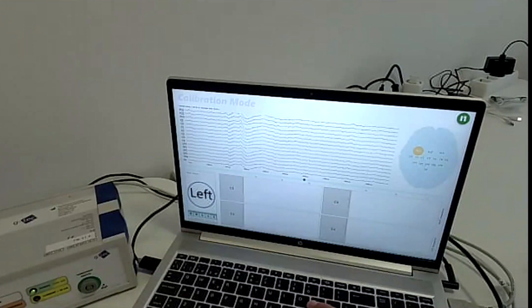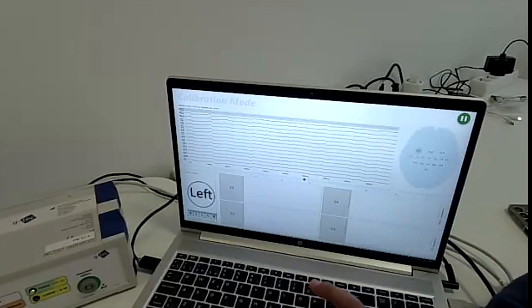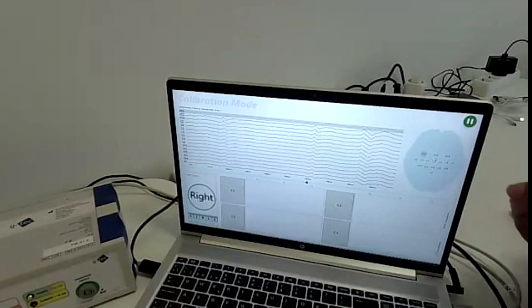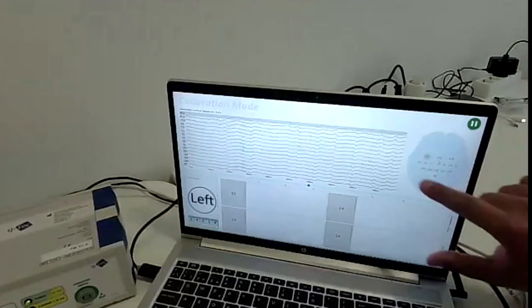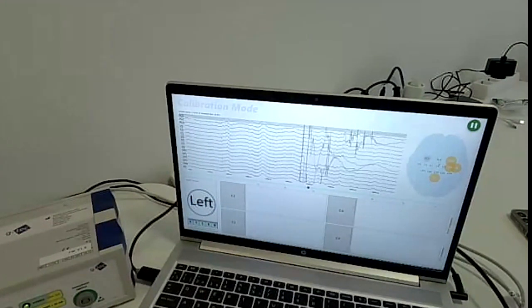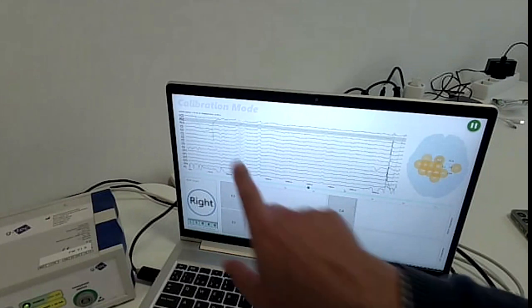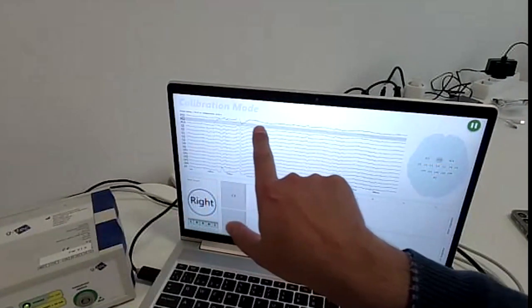Here you can see 16 EEG channels. Exactly, the data looks nice. And on the right-hand side, you can see a brain overlaid by the 16 electrodes. Mark, go ahead with the explanation. As you can see here, all the electrodes are in green color. I will now move some electrodes, and you can see how the signal gets noisy and how the quality map on this side changes colors. For example, I'm going to touch this electrode, the FCZ, the one that we have in the front. We can see the artifact here, and then it gets stable again very quickly.